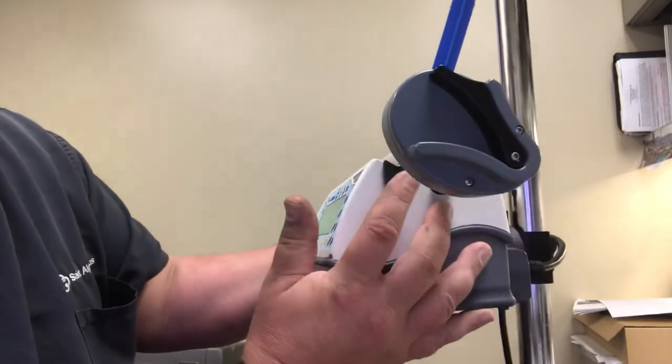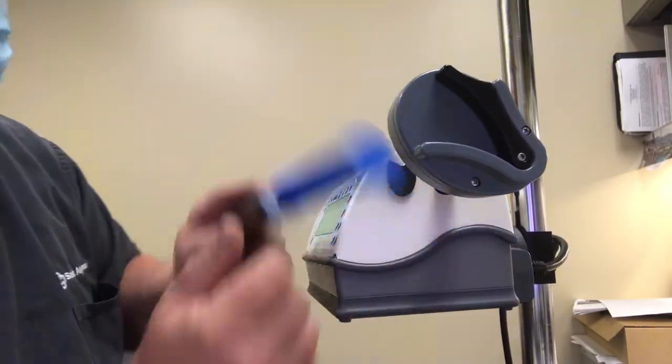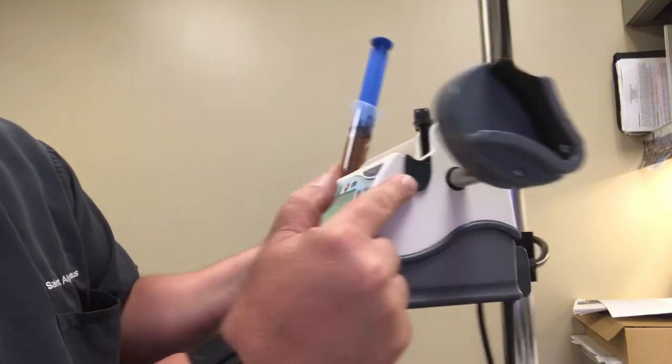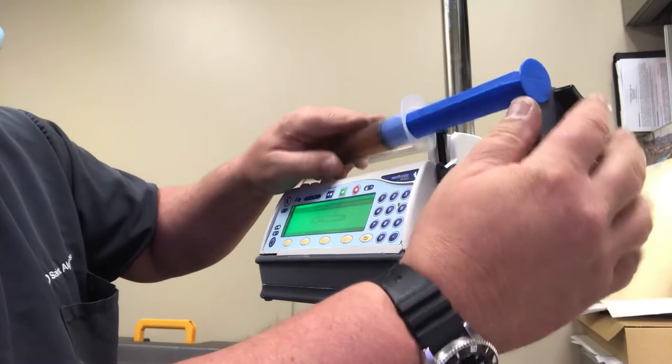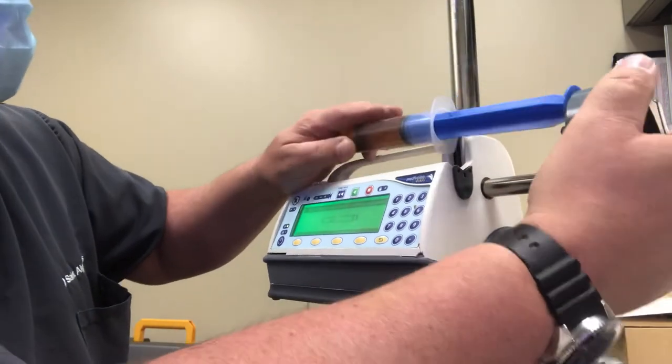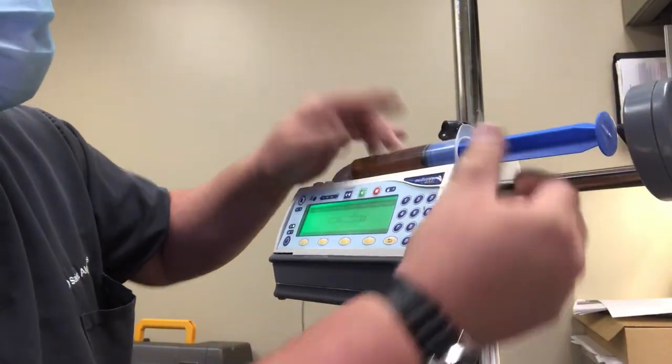And this little piece right here is kind of important, you have to be able to fit this flange inside of here between the pump and this or the machine will sit there and talk to you about it not being in there.